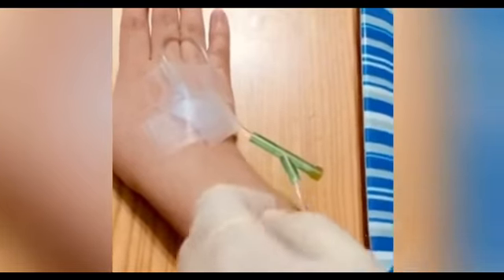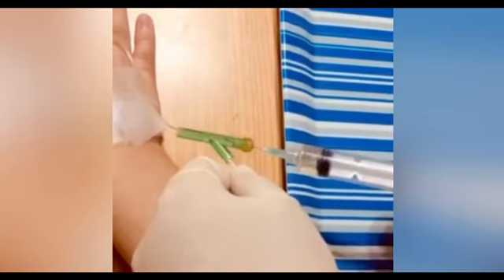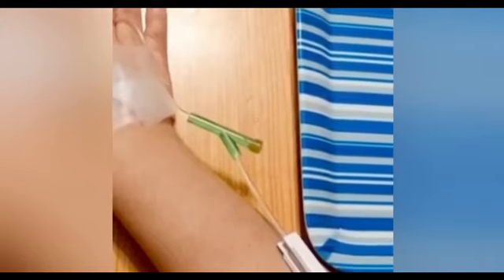Make sure that the IV line is kinked so that the fluid does not go back into the IV line. After flushing, we have now successfully given our IV push.